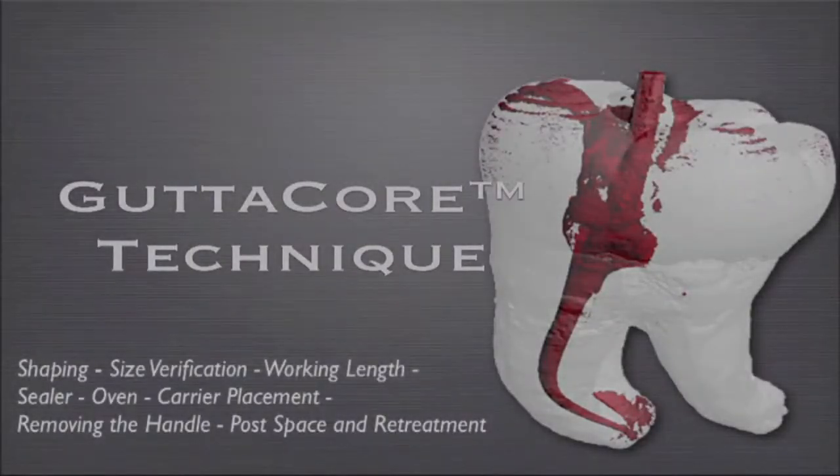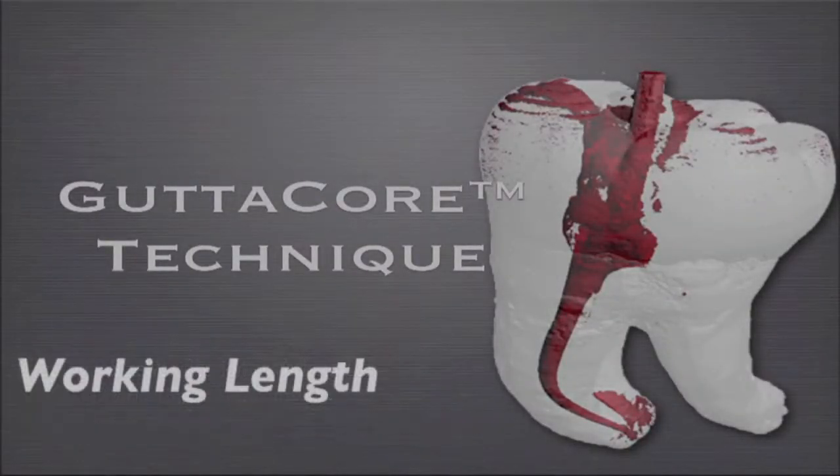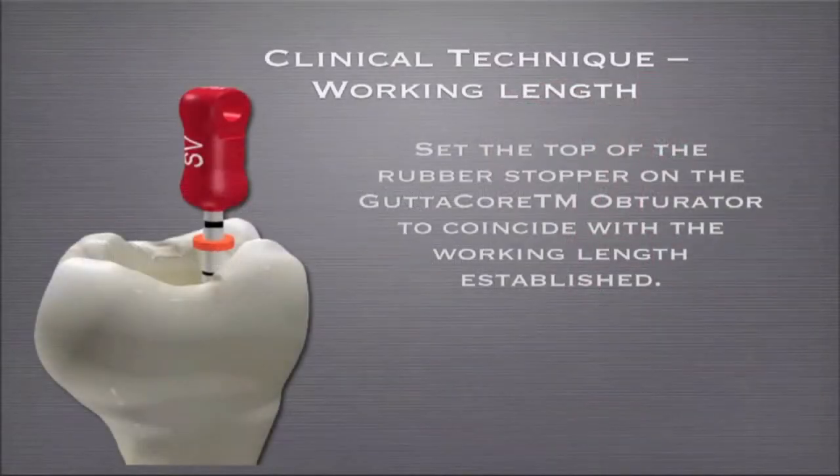Let's talk a bit about technique. This is a concept that gets a little bit confusing because the carrier has gutta percha at the end of it. It doesn't flush to the end of the carrier. So how you determine where to set the stopper is a little bit different than what we're used to. If your working length is 20, it's from the top of the stop on the carrier, not the bottom of the stop.